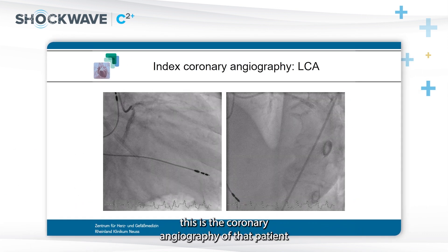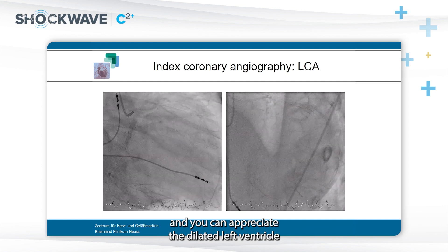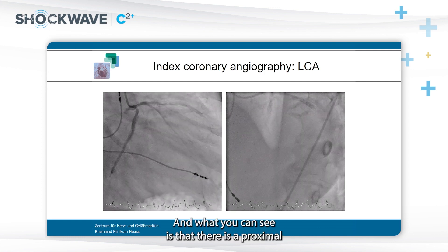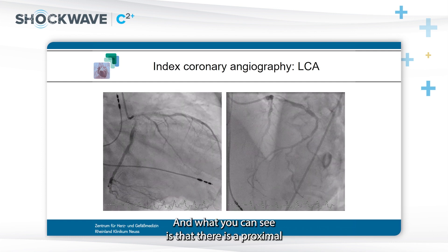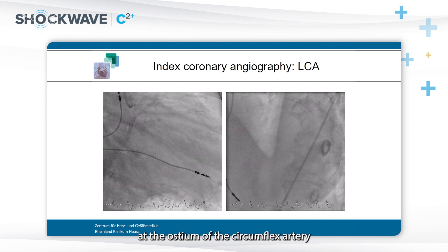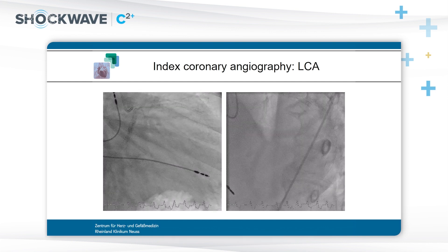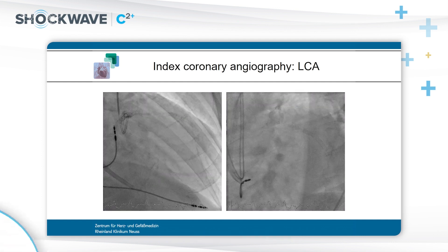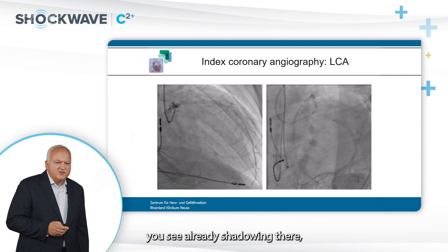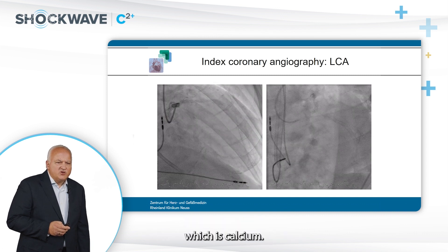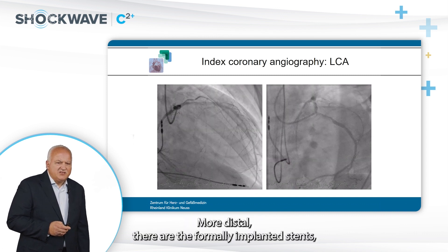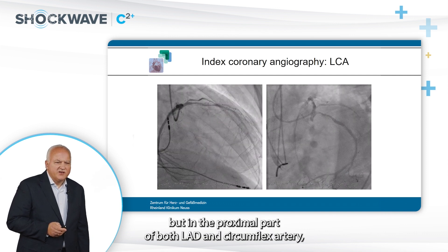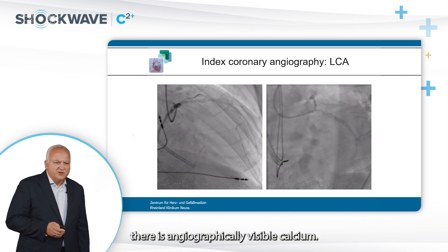This is the coronary angiography of the patient. You can appreciate the dilated left ventricle and dilated heart. There is a proximal, more circumferential stenosis at the ostium of the circumflex artery, and also additional disease in the proximal LAD. Before contrast shows up, you already see shadowing — which is calcium. More distal are the formerly implanted stents, but in the proximal LAD and circumflex artery there is angiographically visible calcium.